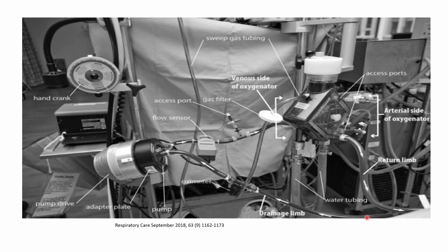The blood is aspirated by the pump, which acts as the heart of the circuit, pushing it to the oxygenator, which acts as the lung of the circuit, then it returns in the return limb to the return cannula. During this process, a sweep gas is added in the oxygenator, allowing gas exchange inside the oxygenator, the same as what happens in the lung.